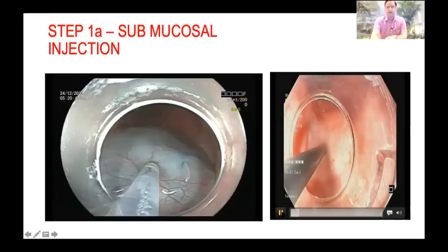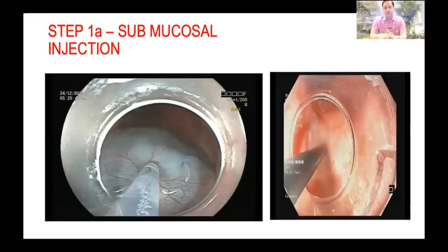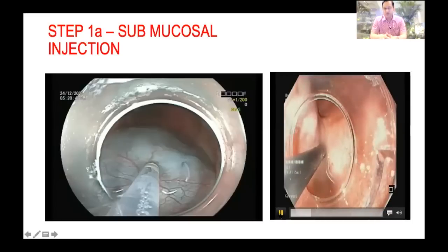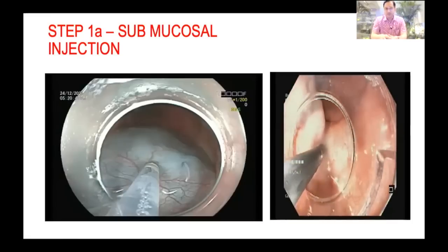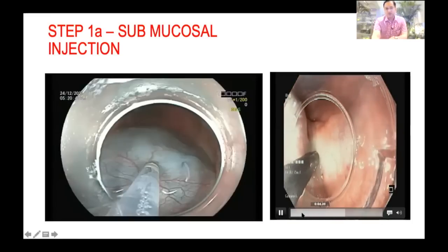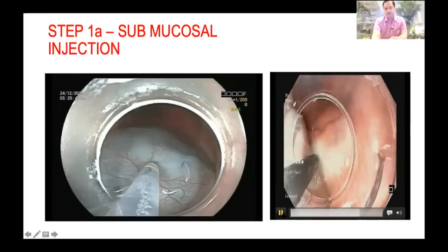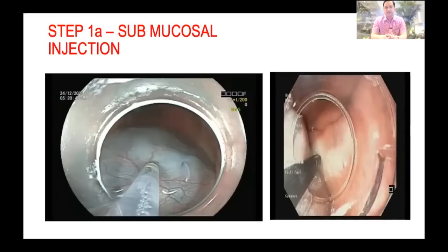If you are not getting a good bleb despite injection, it may be because you are injecting into the muscle or encountering submucosal fibrosis. Here I am injecting at 5 o'clock but the bleb is forming from 6 to 9 o'clock — this is because of focal submucosal fibrosis. Submucosal fibrosis most of the time is not circumferential, so if you cannot do a posterior POEM, you can do an anterior POEM — wherever you get a good bleb, you can perform POEM there.